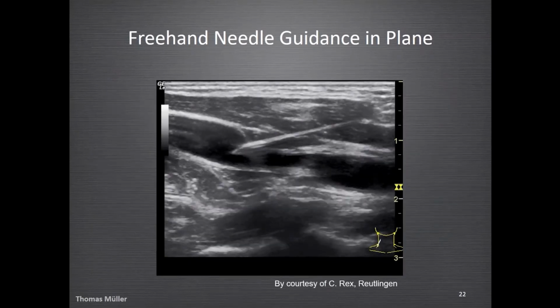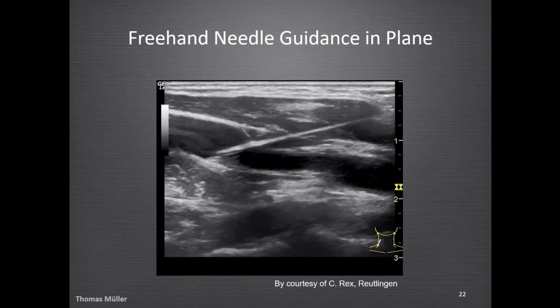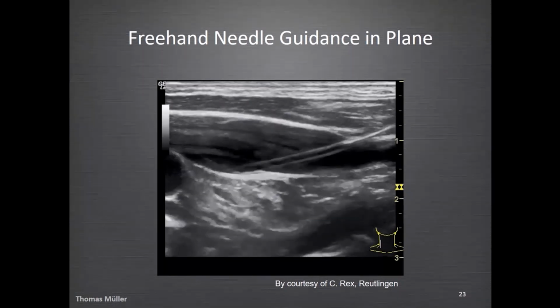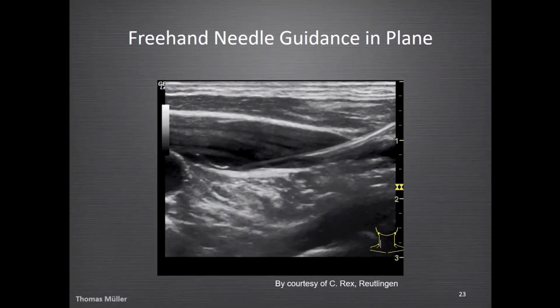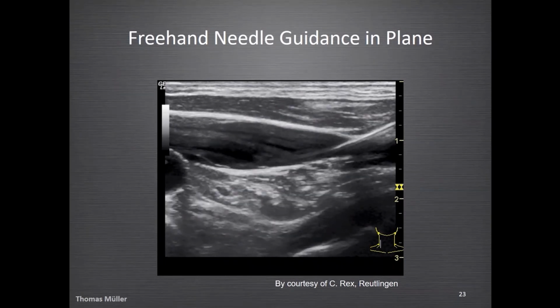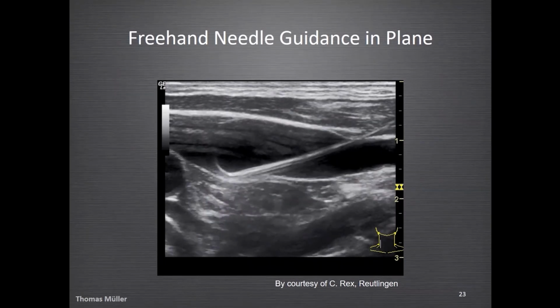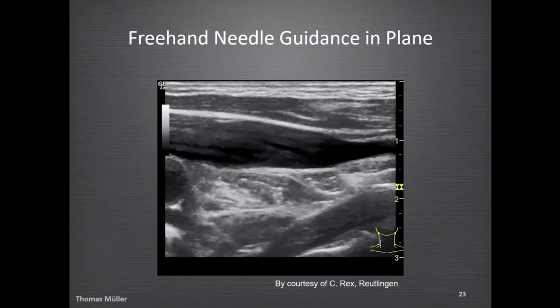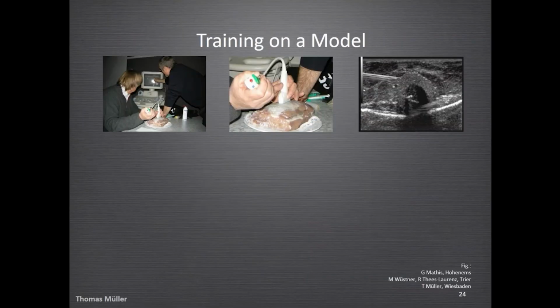One of the very good applications is central venous line placement, IV line placement. Here we have a flat angle. Here we see the needle tip, and we know now we're in the vessel. And it is easy to place the guide wire then, and we have a fine visualization with a flat angle in the in-plane technique, just to show you an example.